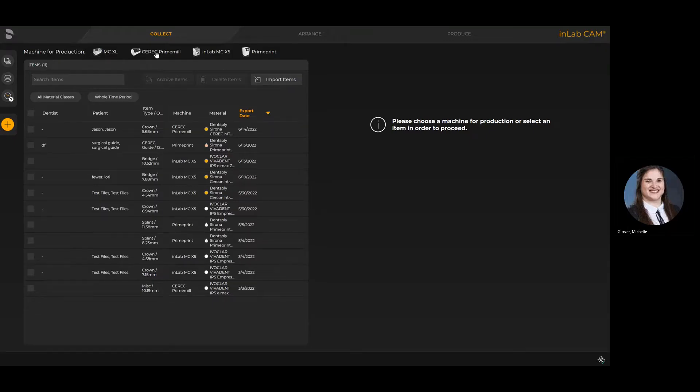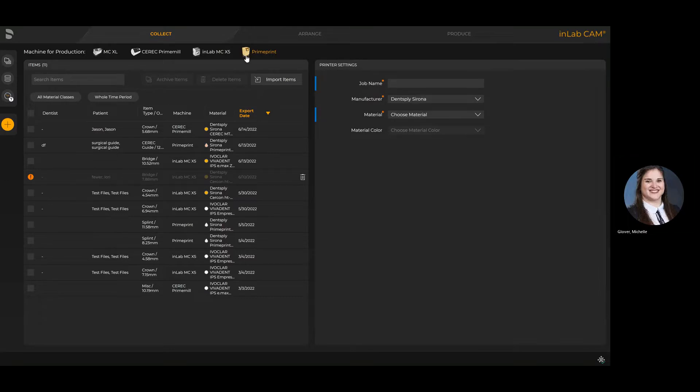When you first come into InLab CAM 22, you'll notice all the machines connected to your unit are displayed at the top. You'll see that CERC PrimeMill and PrimePrint have now been added.